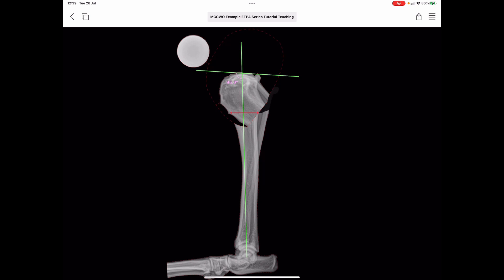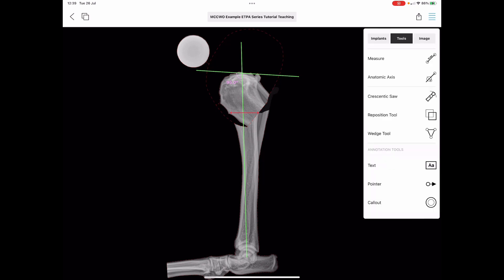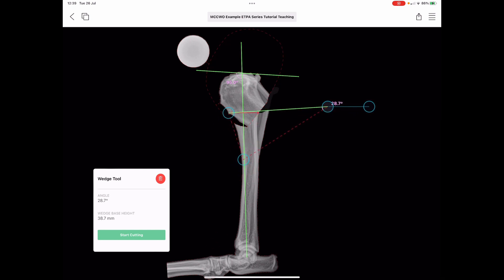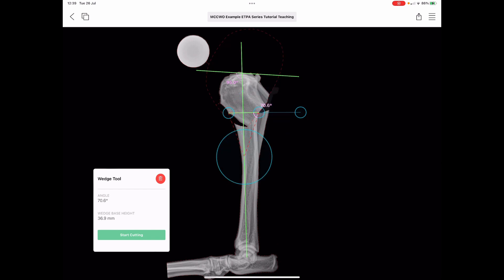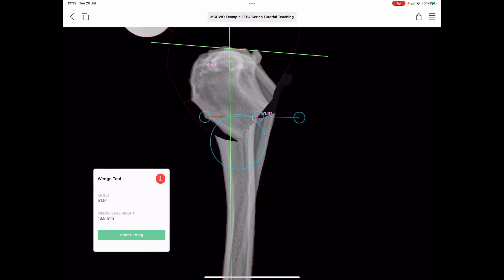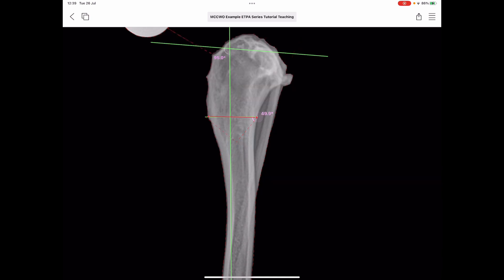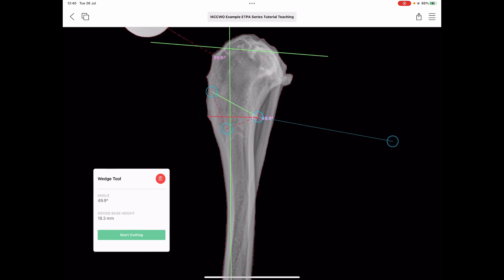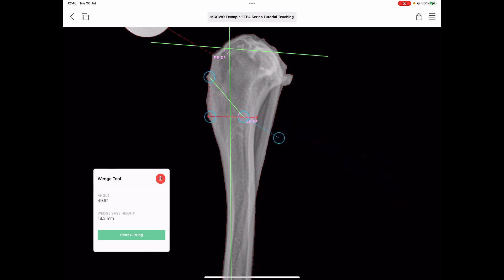The next thing we need to do is define the wedge — the piece of bone that's in the way, superimposed distal to that transverse osteotomy line. Go to Menu, then Wedge tool. The wedge is going to lie over our surplus bone stock. I recommend you place the green hypotenuse component of this wedge at the proximal end, because that's where we define from when we actually execute the wedge.